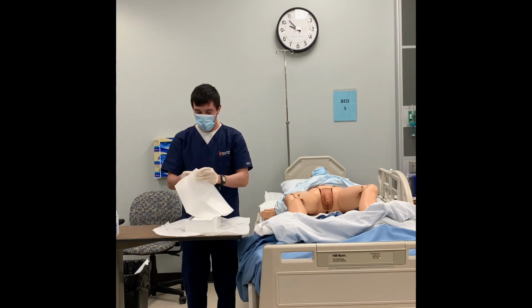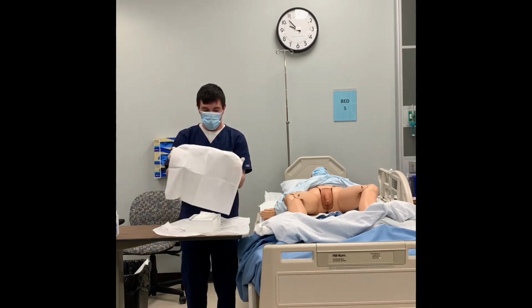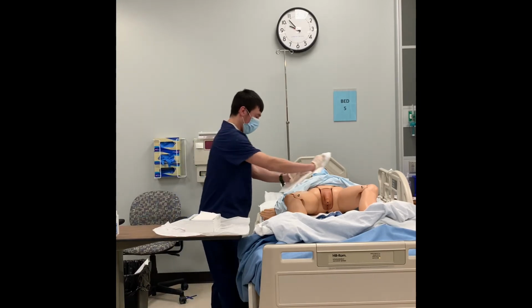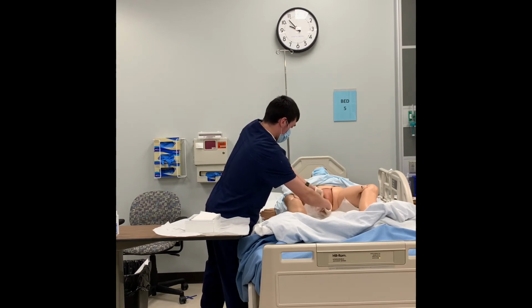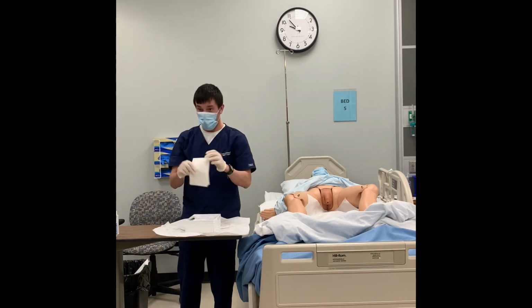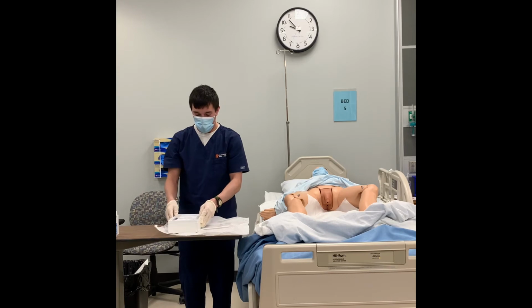This first drape I am going to place underneath the patient. I want to wrap this around my hands, ensuring that I won't touch anything that I should not, to keep my hands sterile. Okay, the second one I'm not going to use, so I'm going to pitch that to the side, and now I have my box that I can adjust.